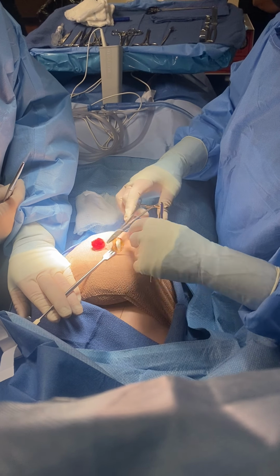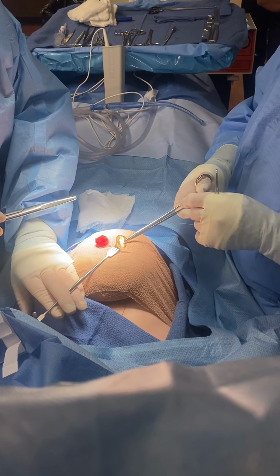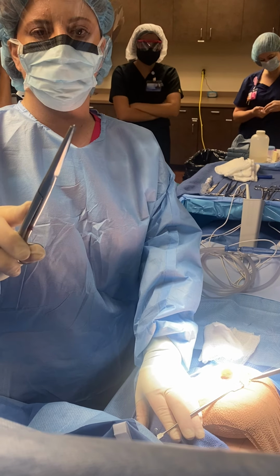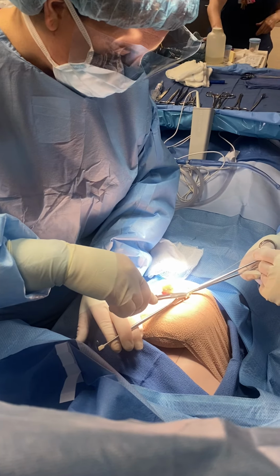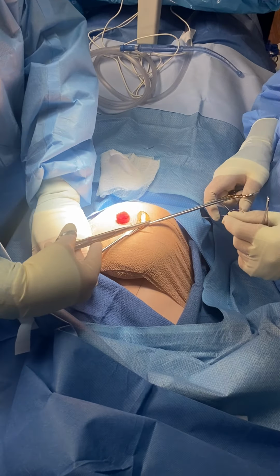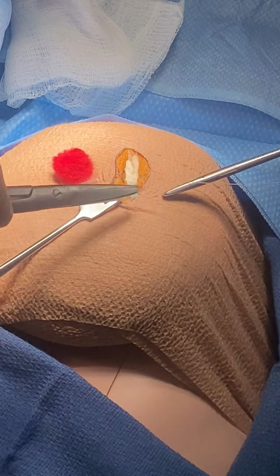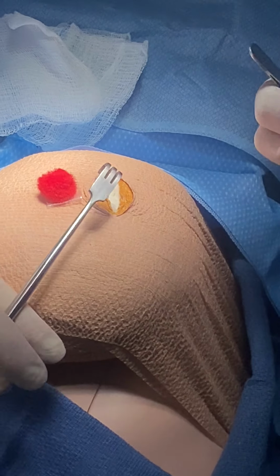So when you cut sutures, surgeons are really persnickety about where you cut it, how you cut it. So when you hold your scissor, it's best if you do ring and thumb and your pointer finger like this. It gives you more control, right? You're just gonna barely open the scissor. You're gonna cut with the tip. Right on the knot. Okay, so I usually turn the scissor so that I can see and the surgeon can see, but sometimes if they want it right on the knot, you're gonna have to just slide down until you feel the knot and then cut. All right, there's a little twig left there.